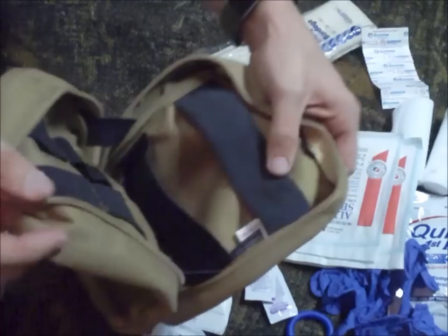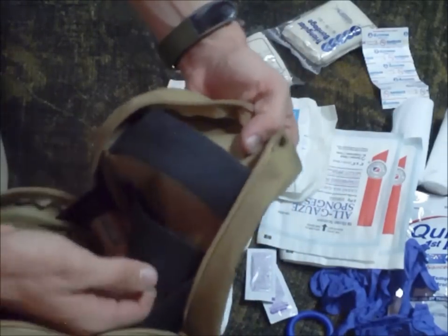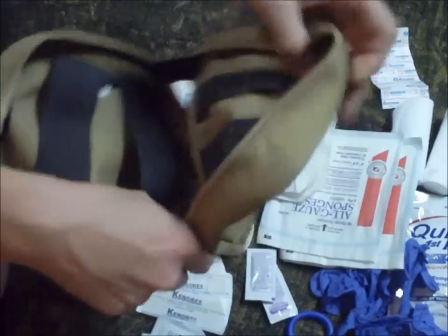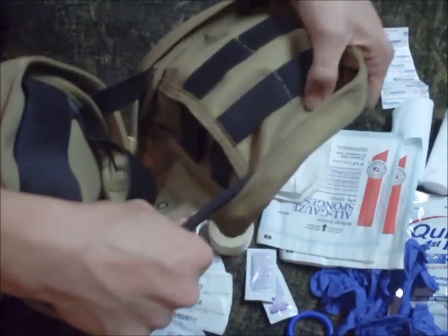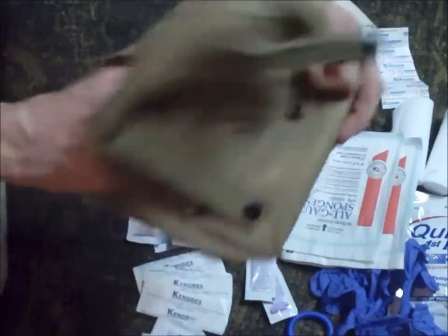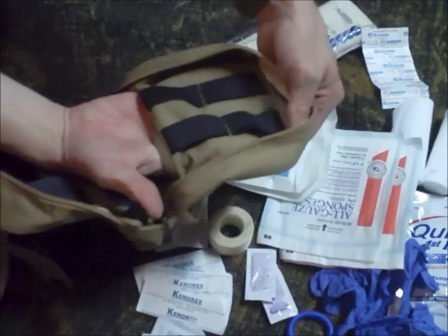Here's a better look at the bag interior. It has nice elastic straps for the bigger components, and then smaller slots going all the way down for smaller items. It even has a nice little hidden pouch that you can stick things into if needed.